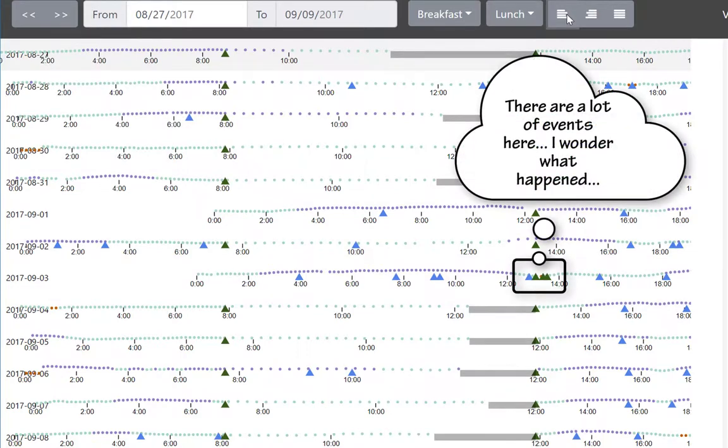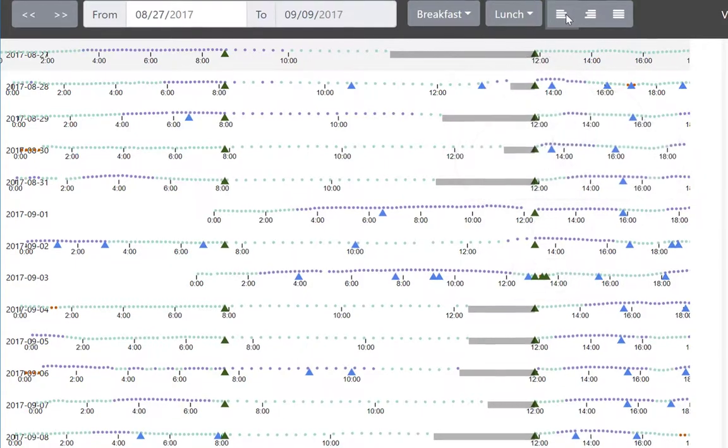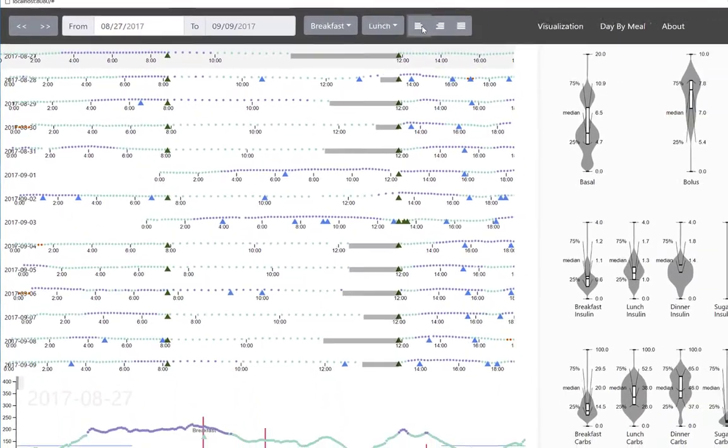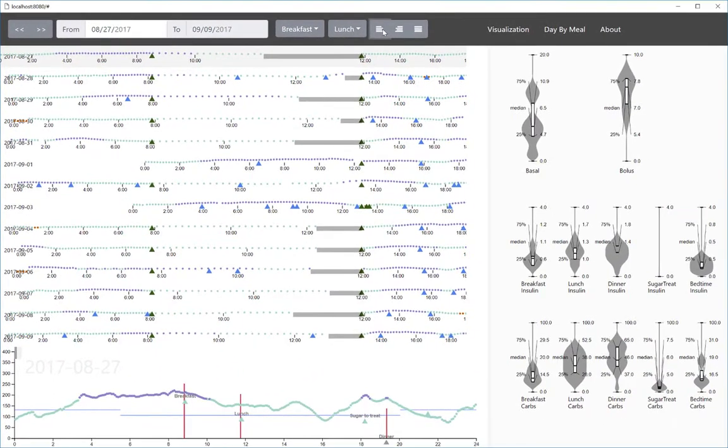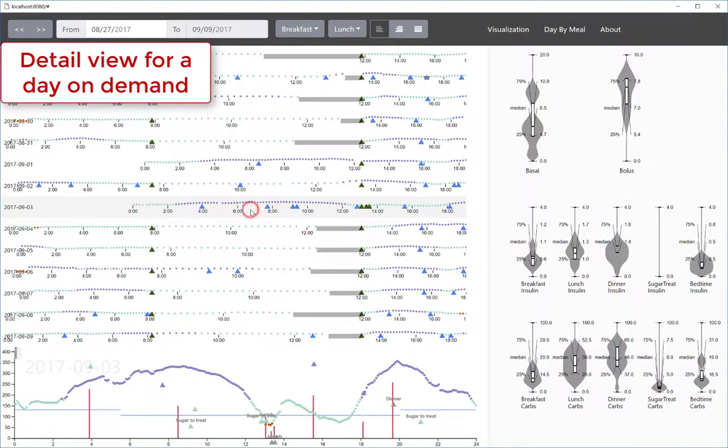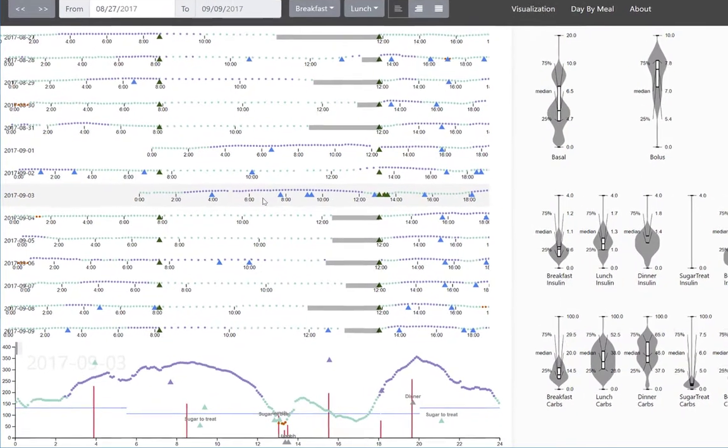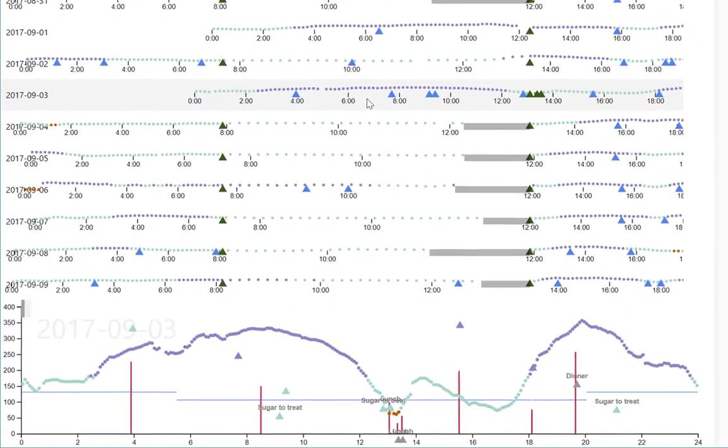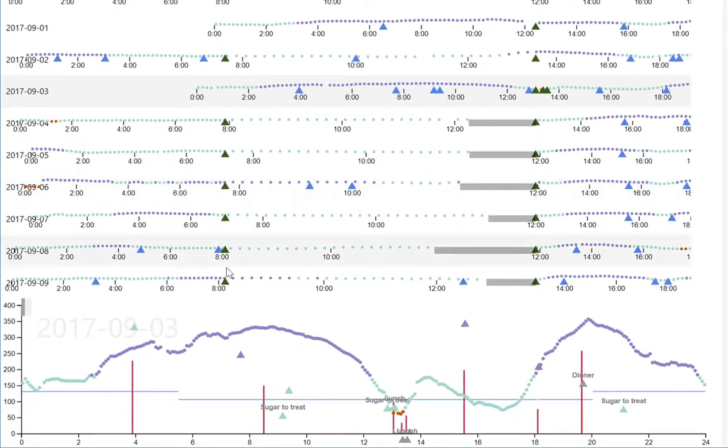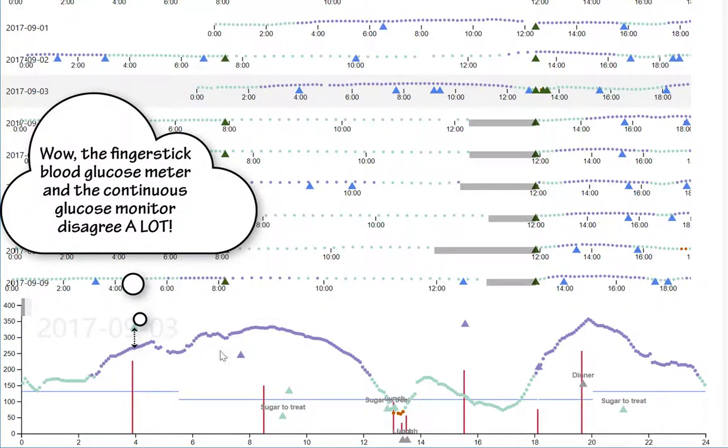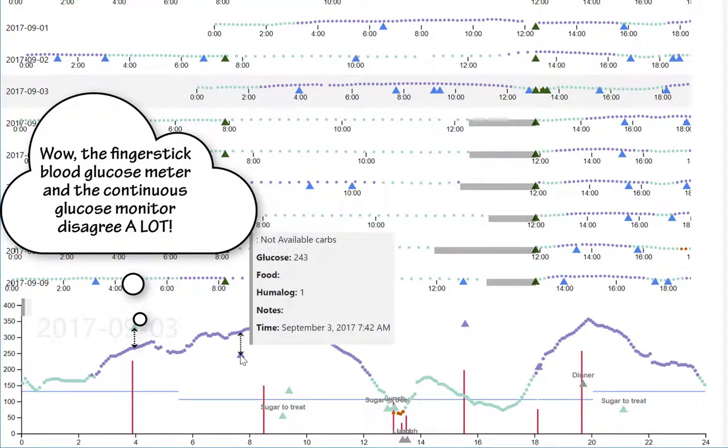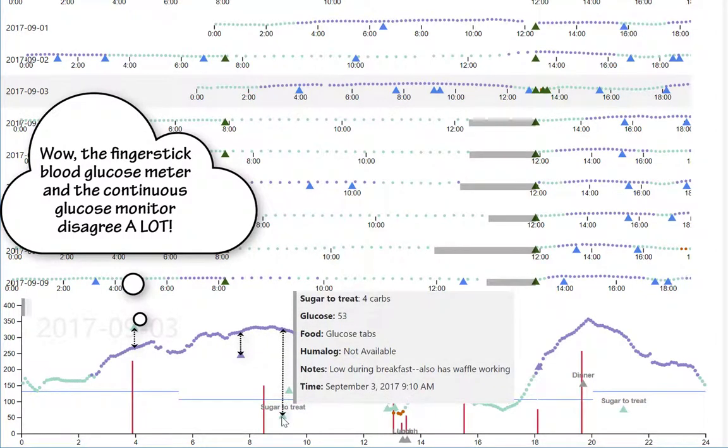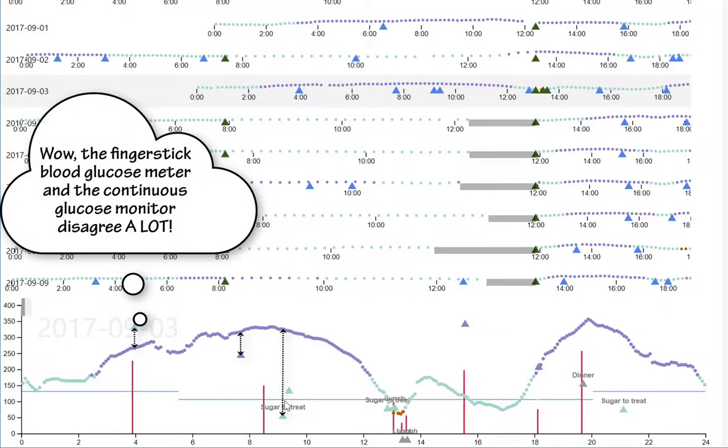Why are there so many lunch events on September 3rd? Let's select that day and look at its detail view. Wow, the blood glucose readings using the finger stick blood glucose meter, which is considered the gold standard, are quite different from the ones we're getting from the continuous glucose monitor. We might need to educate the patient on how to calibrate these monitors effectively so that they're much more aligned.